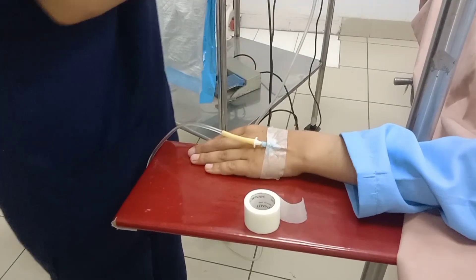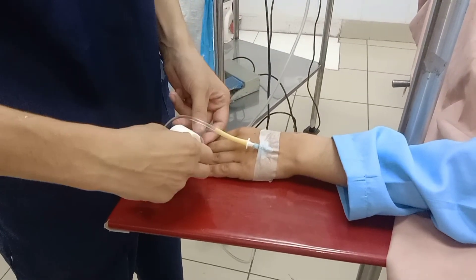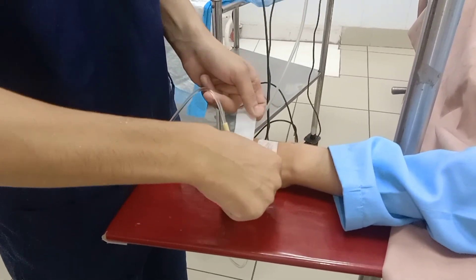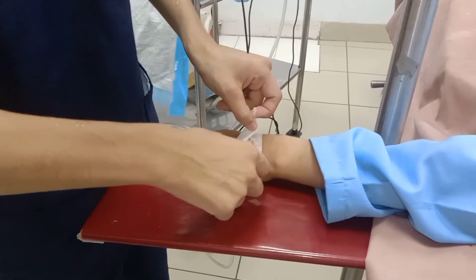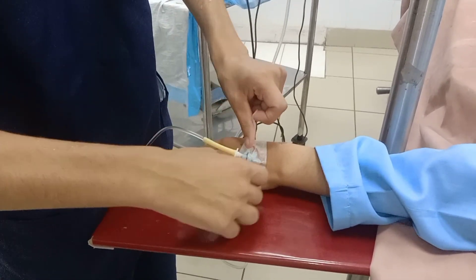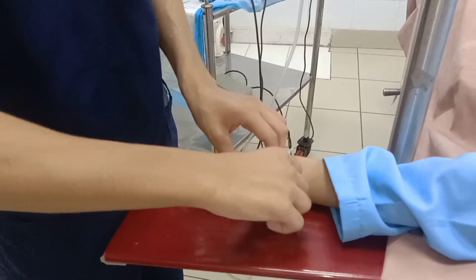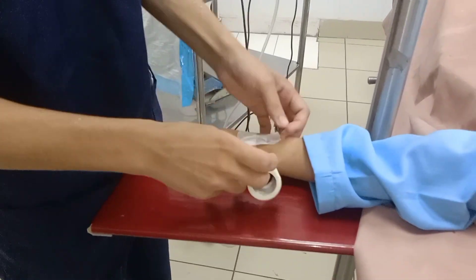The surgical team completed the safety and preoperative checklist, confirming the patient's identity, procedure, and consent. After final confirmation, the surgeon marked the incision site and the surgery was officially started under sterile conditions.